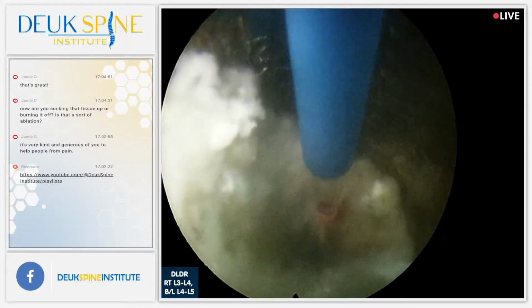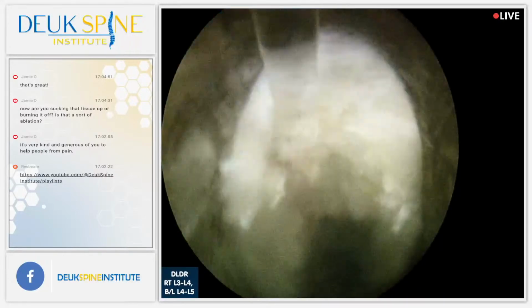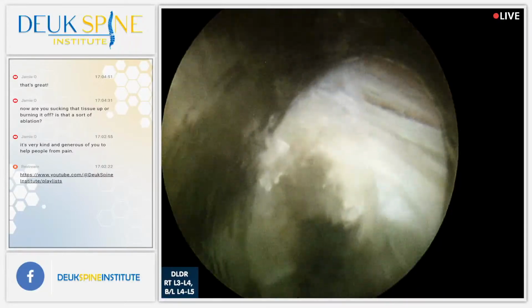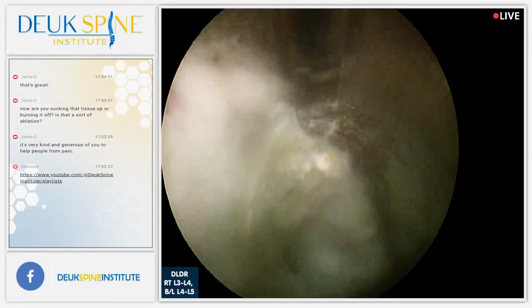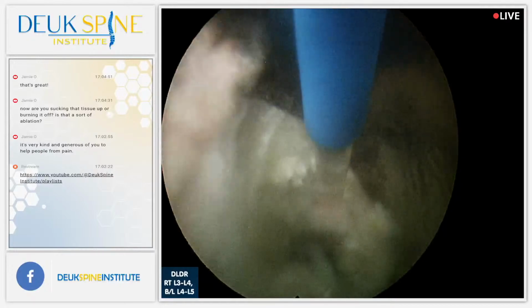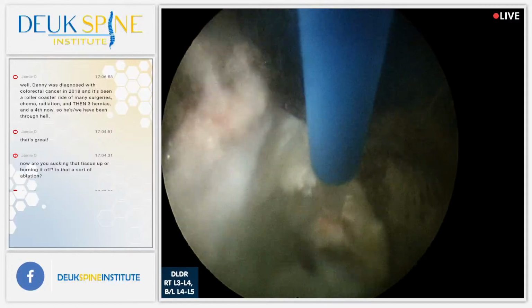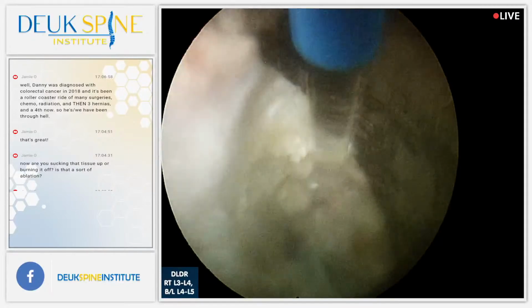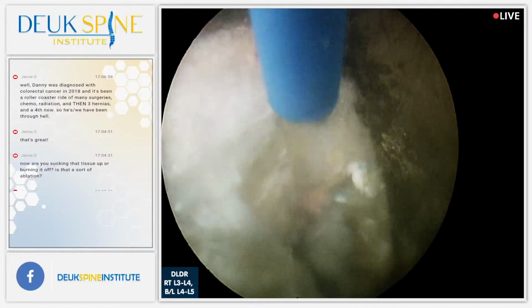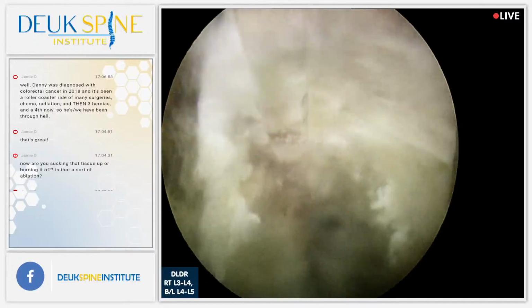All right. Any more questions? Yes, we have another question from Jamie once more on YouTube. They ask, now are you sucking that tissue up, or is it burning it off? Is that some sort of ablation? Yeah, Jamie. So we're blasting it into little pieces, and then they're being sucked up and out. You're correct. Coming up the tube.